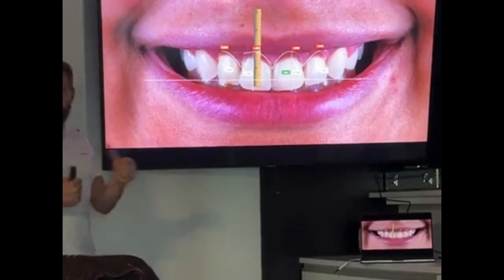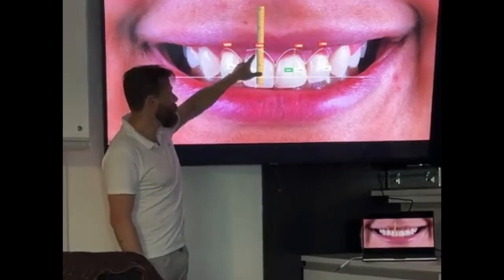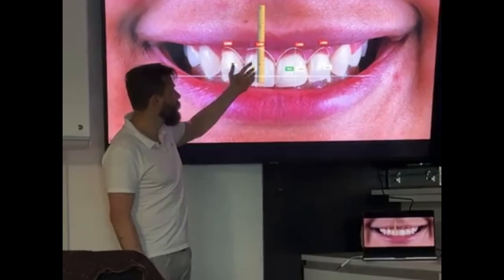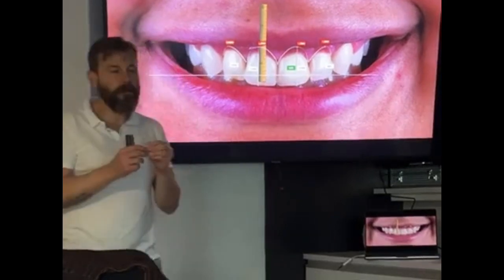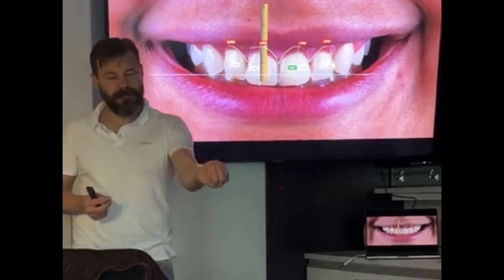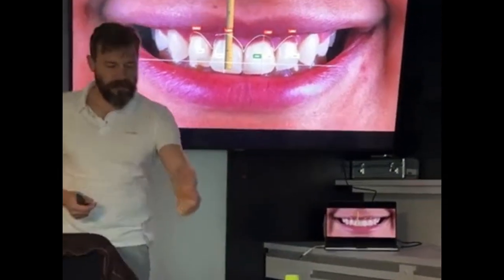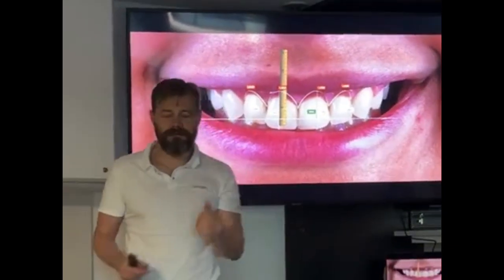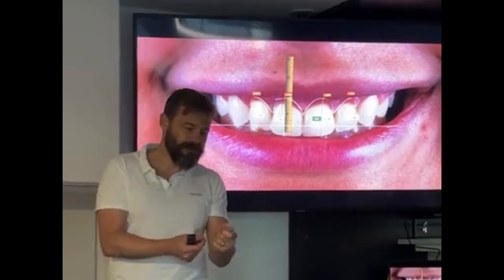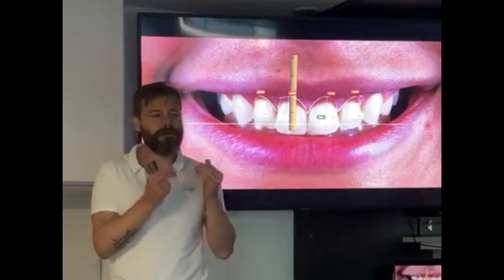If you take the same treatment plan from the beginning and apply that, you're going to see that I have extra gingiva of 1.4, 1.5 millimeters that I need to redesign. The question is how to condition that. If you try to do that straight in the mouth of the patient, this is a completely crazy process because you do not control, you're not precise. You take one provisional, you add some composite, then you need to push back, smashing the gingiva to check. Oh, need to add more, then you add more, 50 minutes, then it's too much. You do not control the process.